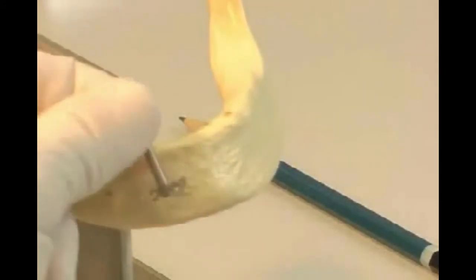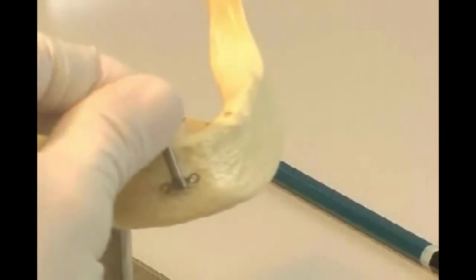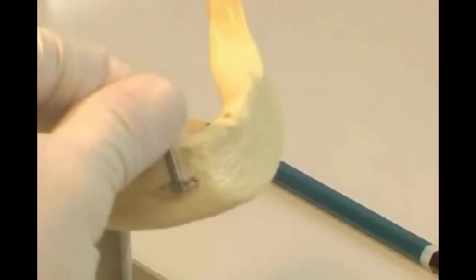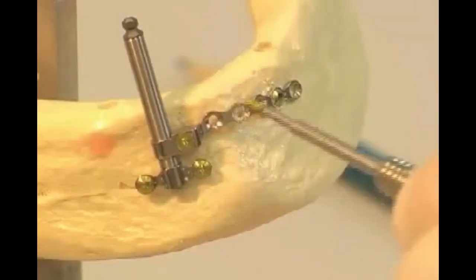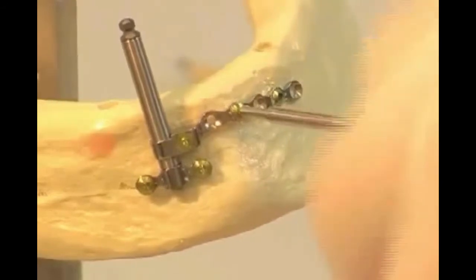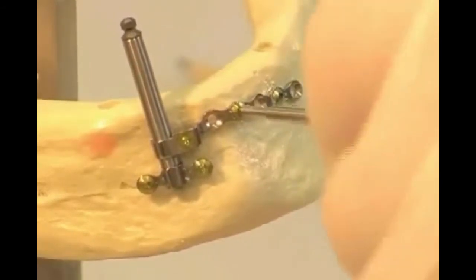This requires some hole drilling. During actual operations, the drill has to be cooled off with water in order to avoid heat damage to the bone. After the drilling holes have been set, the distractor is secured with small screws. Later on, when the bone has fully regenerated, all screws and parts will be removed. You now see how the last screw is being tightened.